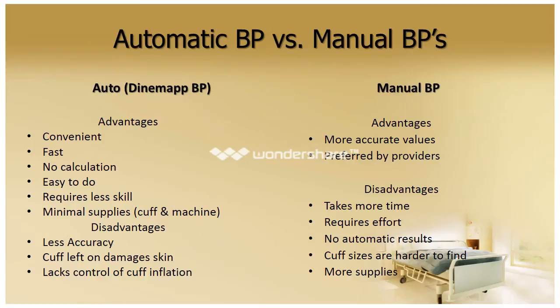If you're not in an ICU area where patients are constantly monitored with arterial lines or pulmonary catheters, there are usually 2 ways that we take blood pressures. We take them automatic or with the Dynamap. In some places, if they don't have a telemonitor, we'll use the Dynamap, or on our telemetry floors, we have the monitors that we connect the blood pressure cuffs to.